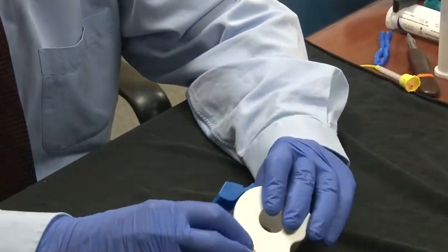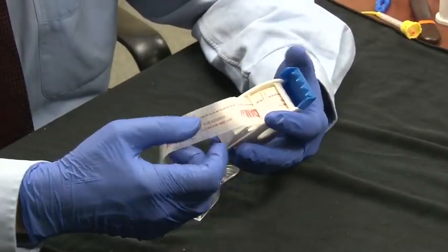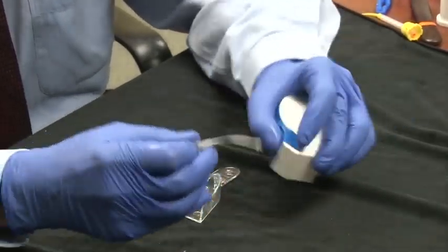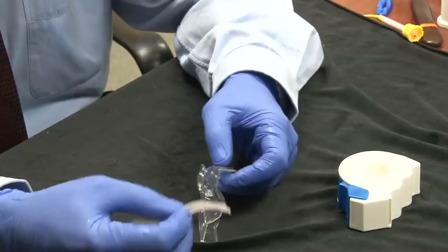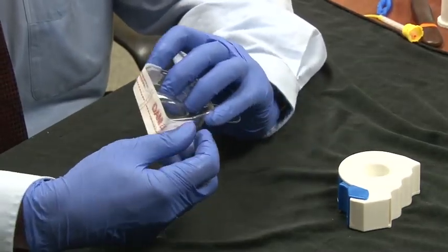Another time that you could use the Dammit is just on your regular alginate study models. So if you just, again, take some out, put it on the back of your tray. You've already sized your tray. Everything's fine. Put it across the back.